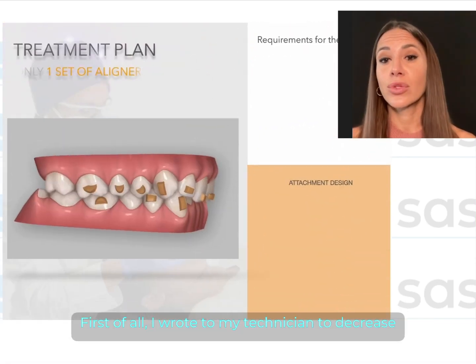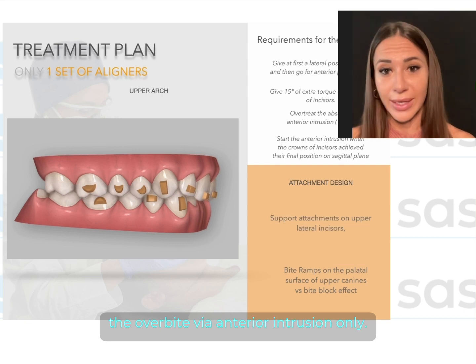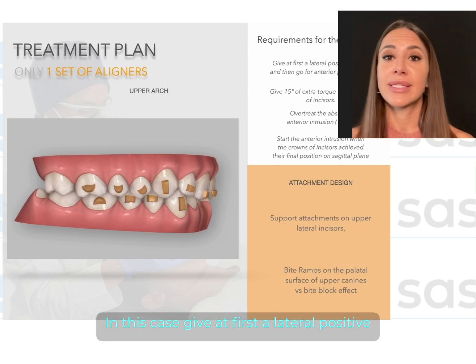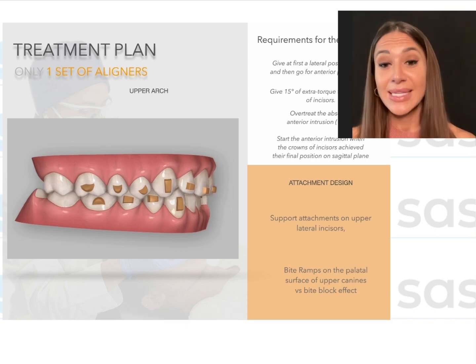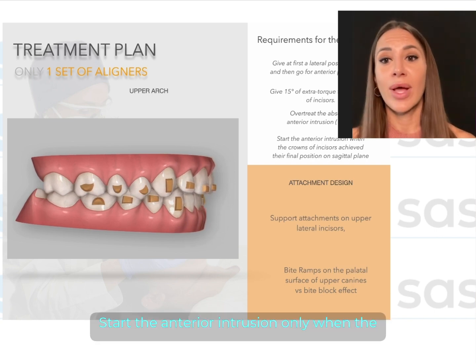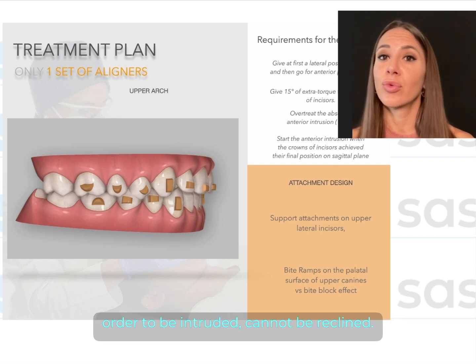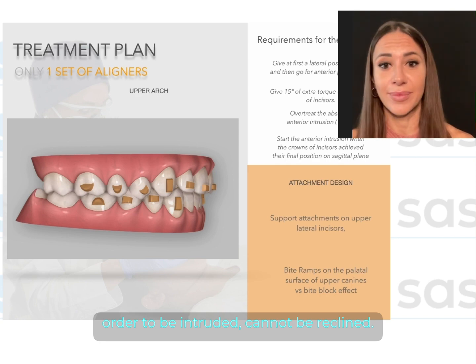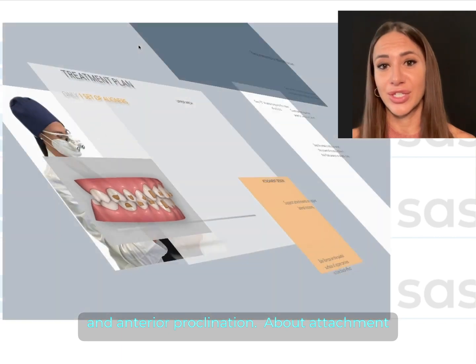First of all, I wrote to my technician to decrease the overbite via anterior intrusion only. In this case, give at first a lateral positive torque and then go for anterior proclination. Start the anterior intrusion only when the crowns of incisors achieve their final position on the sagittal plane, because incisors, in order to be intruded, cannot be retroclined. Finally, overtreat the anterior intrusion and the anterior proclination.